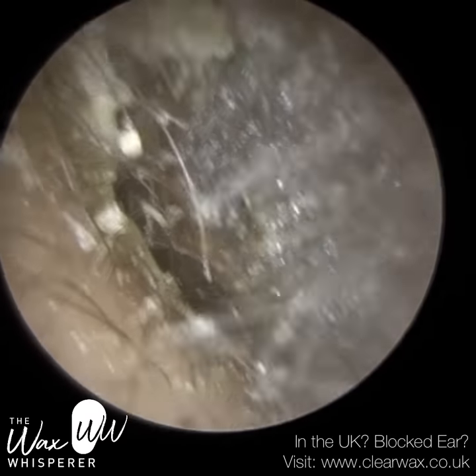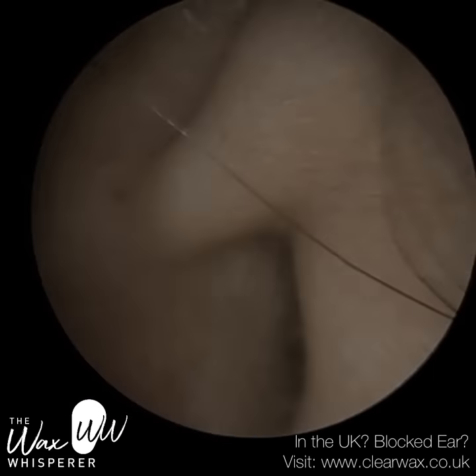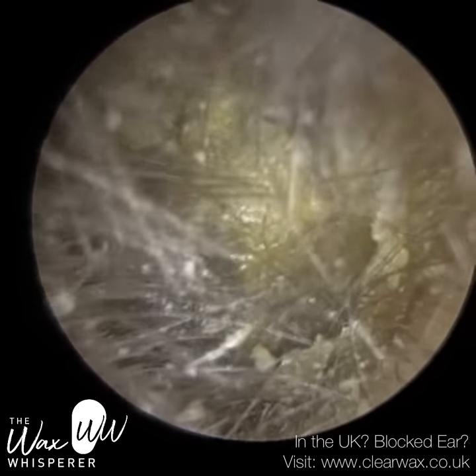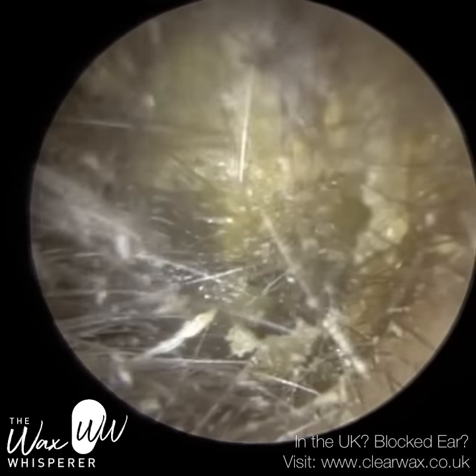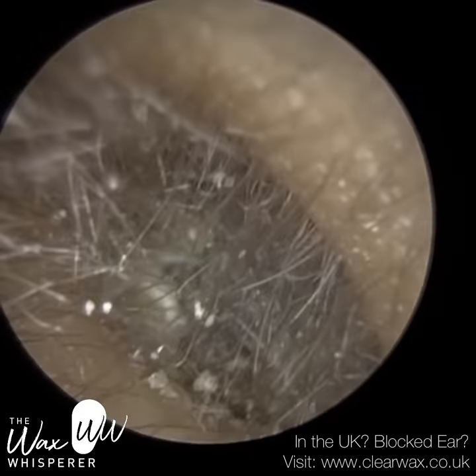Hi everyone, this is Mr. Neil Reiteter, also known as the Wax Whisperer. Thank you for joining me in my latest video. We have here a patient who attended with fully occluding, matted, dry earwax and dead skin.